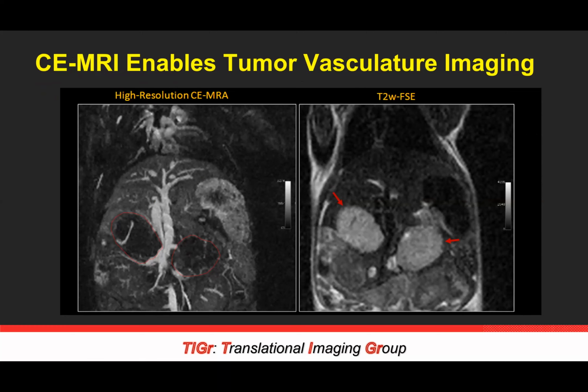Here, we're actually just using it as a true blood pool agent, where we're watching it accumulate in blood vessels, both the larger vessels like the IVC, where we can see infiltration of these lesions into the IVC. You can kind of see it's cut away here. And we can also visualize development of draining vessels on the periphery of the tumor volume.